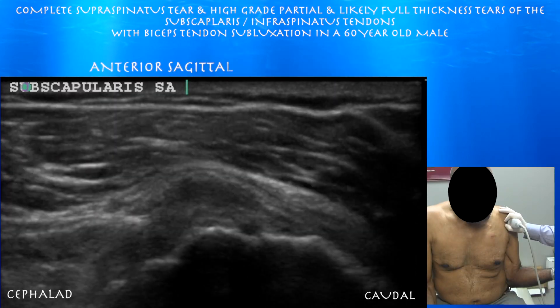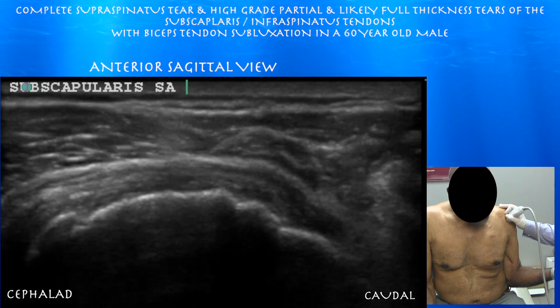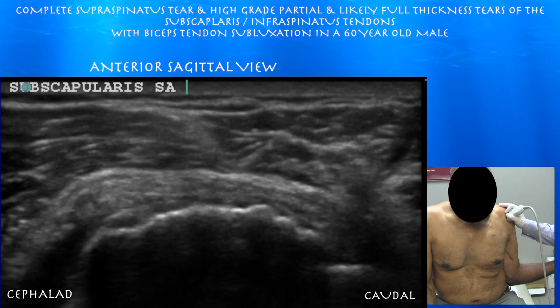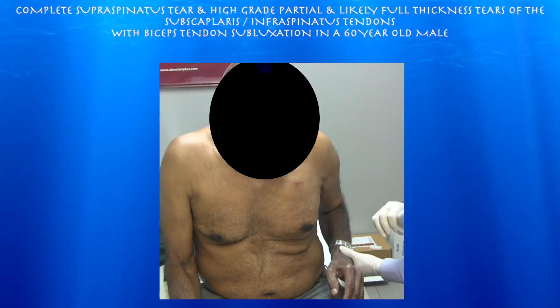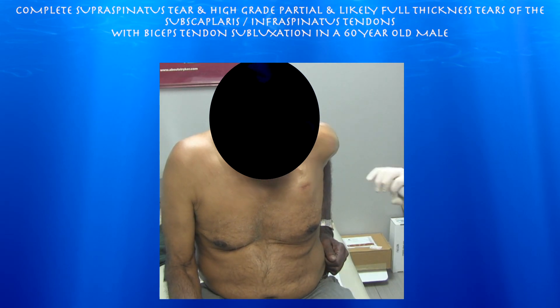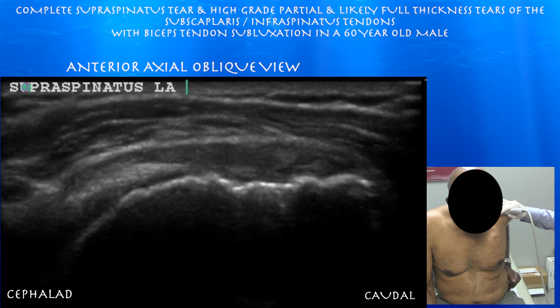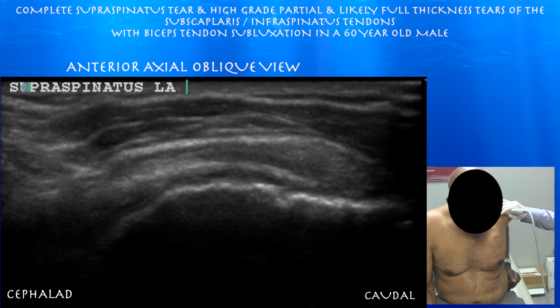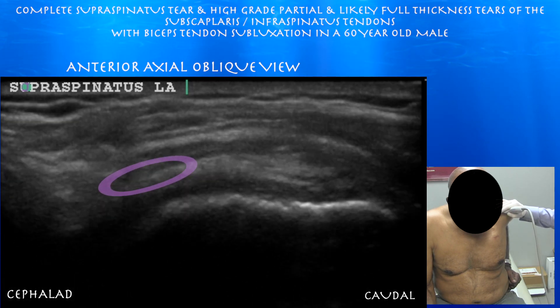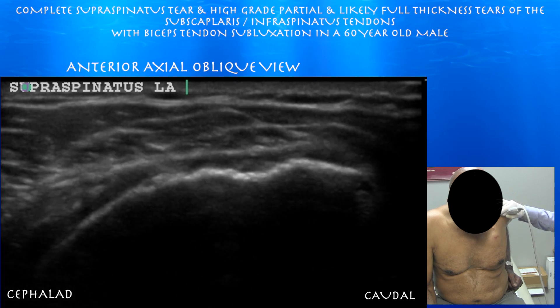You can kind of see the biceps tendon here. As you go higher up in a sagittal plane with the probe, the biceps tendon will be in cross section as it curves over towards the superior aspect of the glenoid. You can appreciate a large isoechoic subdeltoid bursitis sitting on top of a very thin subscapularis tendon. Now in the modified CRASS position looking at the supraspinatus tendon in long axis — I'm seeing a large isoechoic subdeltoid bursitis. The very large subdeltoid bursa is essentially just pushing down almost hitting the humeral head, and there's really no supraspinatus tendon. What you might think is supraspinatus tendon is just part of the peribursal fat — don't want to mistake that for supraspinatus tendon.